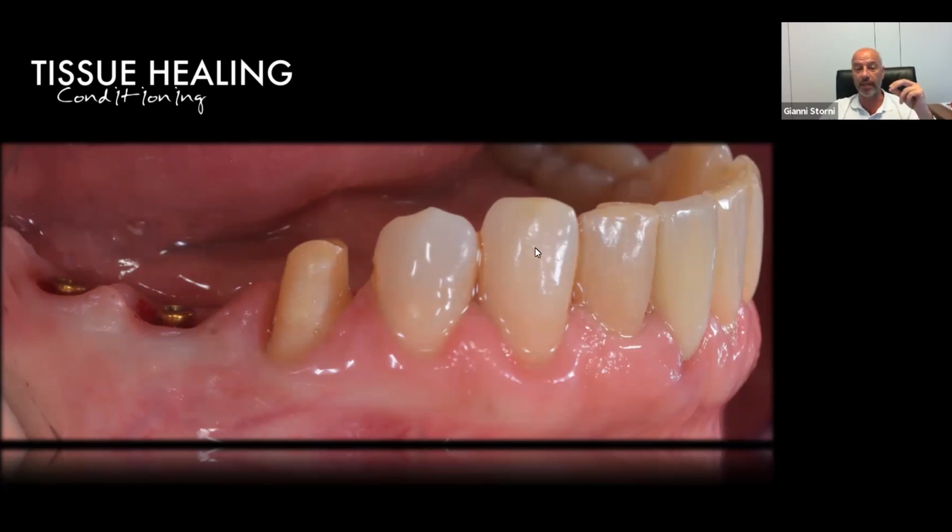And what is very important is that these Equators are available for all the implant brands in the market. So you only have to communicate to Flores Dental which implant you are using, which diameter, and how tall you want the Equator cuff, 1, 2, 3, 4, 5. There is for sure Thanasis, who is helping you a lot on this technical issue. So we really like that you try it, because we know that it's working very well.